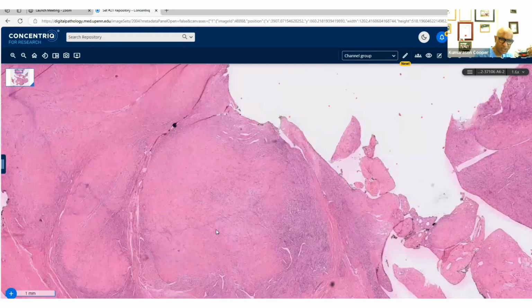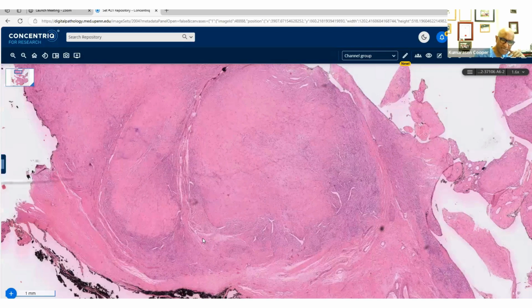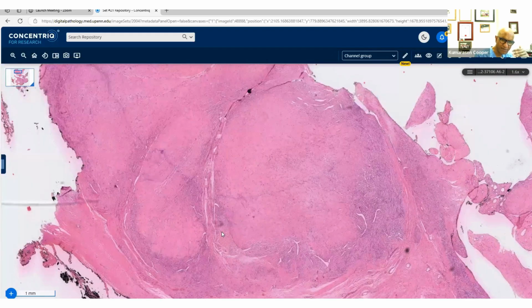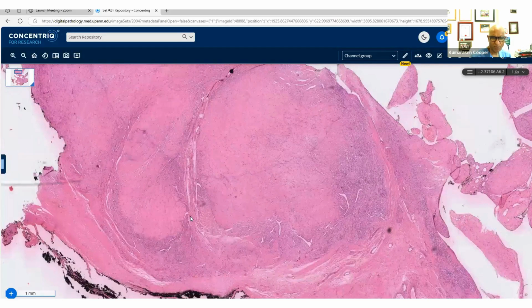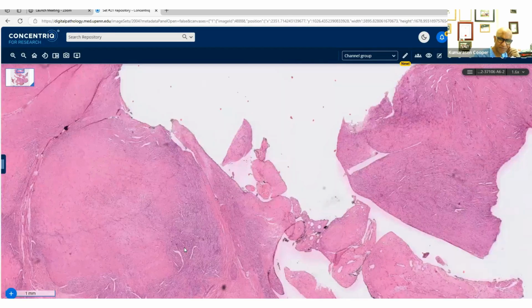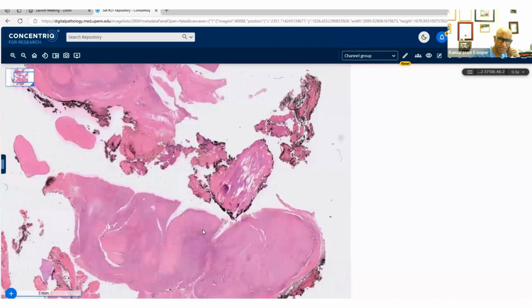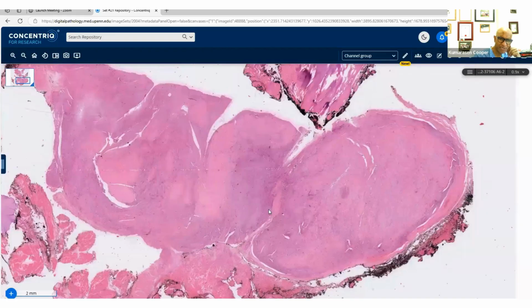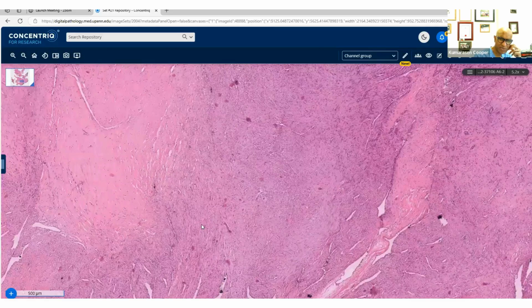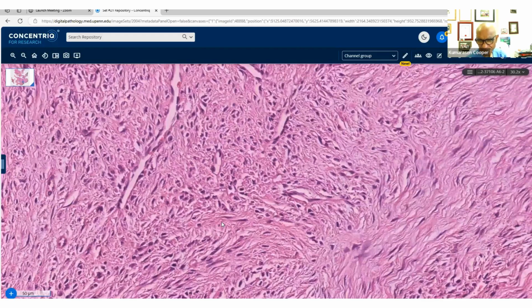What if I told you that this was from the digits, from the extremities, say an acral distribution involving fingers or toes? Would that help? Or palm or wrist? Let's look at these multinodular areas with fibrosing areas, and then these more spindling areas. Any other thoughts?